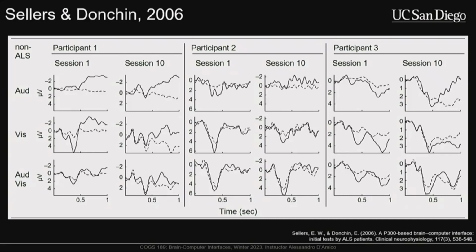Anyway, here are the healthy participants. Their signals are looking pretty good. Participant 2 is weirdly getting a pretty strong P300 both from targets and non-targets. So it's not particularly discriminable. This might be due to not understanding task constraints correctly.